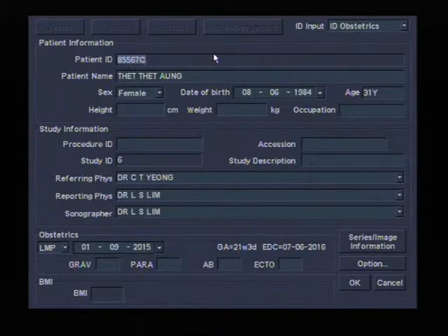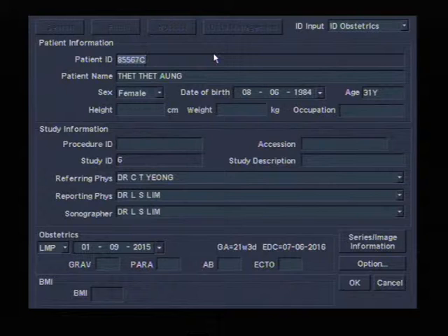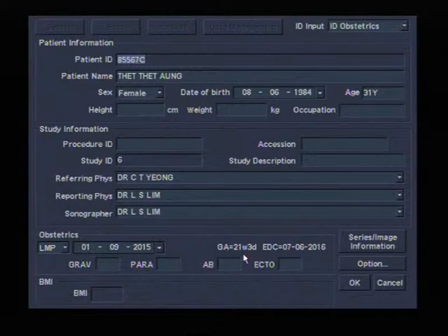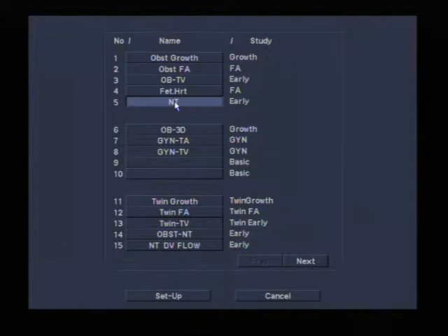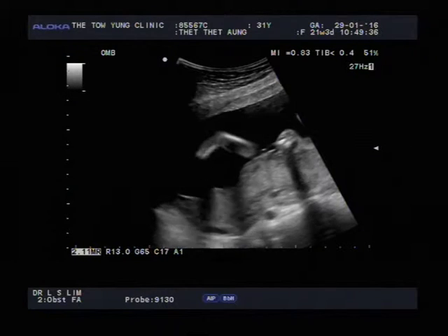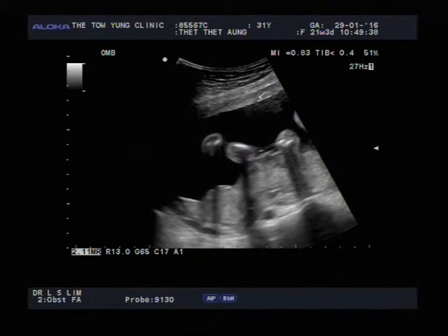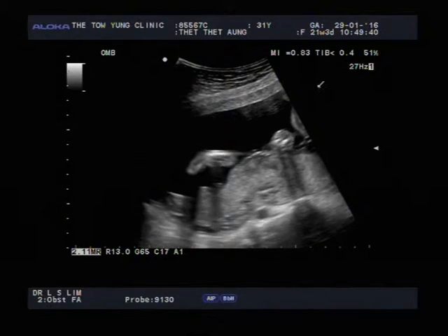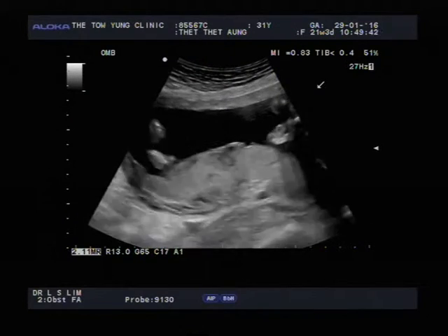Okay, now in session — spread the jelly. So we are about 21 weeks into your pregnancy. Let's take a look at your baby and go through the obstetric scan. There's an arrow on the screen — can you see it? I'll use the arrow to point things out to you.